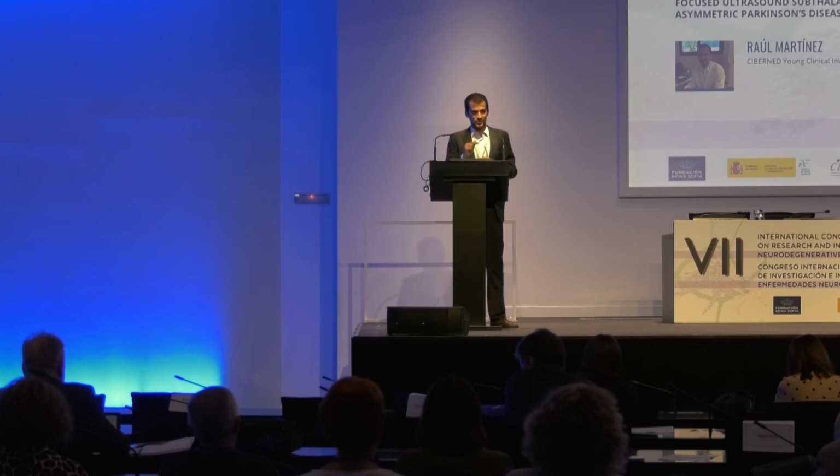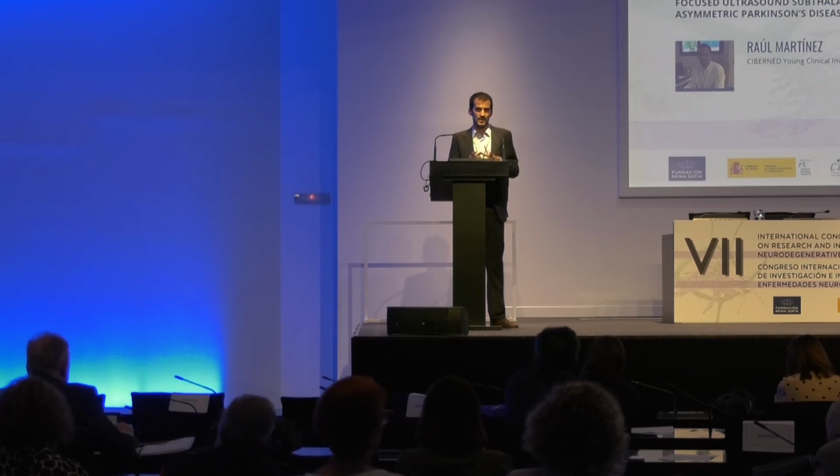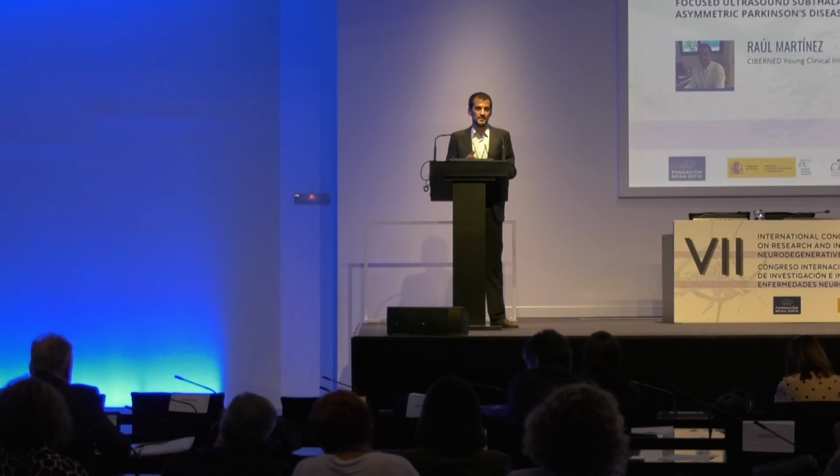Even though lesions in the pallidum can be done, there is a trial ongoing, and we are involved in it, with pallidotomy. But this trial tries to show improvement of motor complications, motor fluctuations and dyskinesia. So we decided on the STN because we think it's the most effective target in PD for motor features.